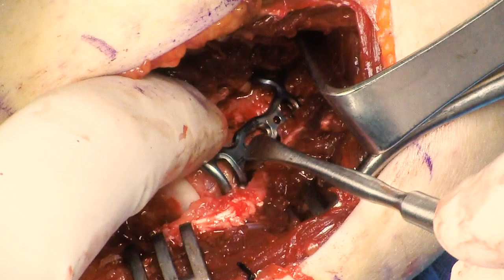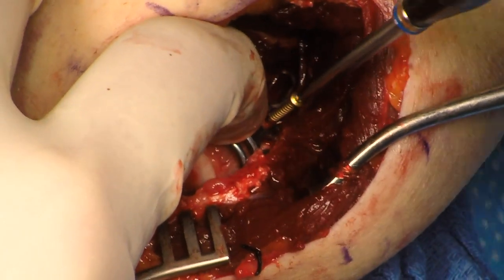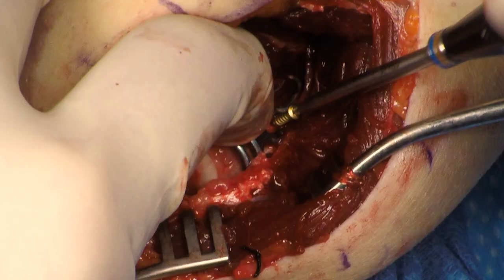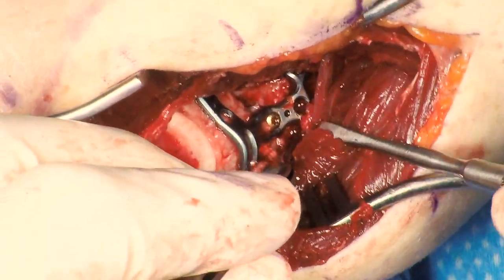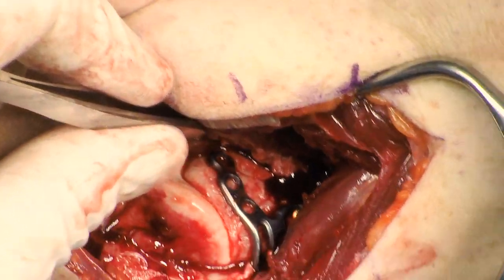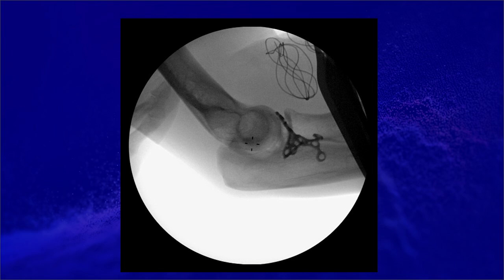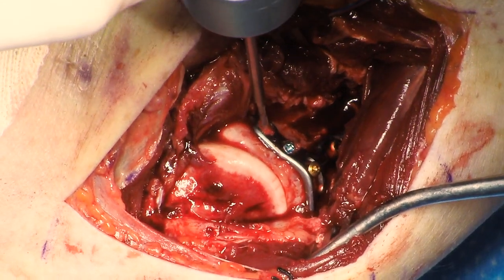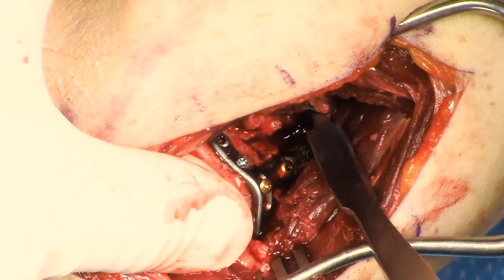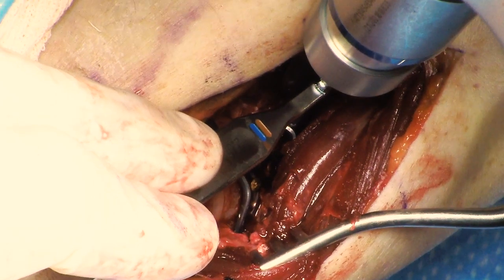You do want to make sure the plate is sitting on the ulnar shaft distally. A screw is placed in the oblong hole. Visual inspection of the fracture reduction and plate placement is then performed. The elbow is placed through a range of motion. You do want to make sure that the most ulnar screw hole is not in the joint. Fluoroscopy is used to assess fracture reduction and plate placement. The remaining screw holes are then filled. The screw holes up on the top of the flange going across the coronoid do not typically have to be filled entirely, as it can be hard to avoid the joint with these screw holes. This plate is mostly a buttress plate on the coronoid.